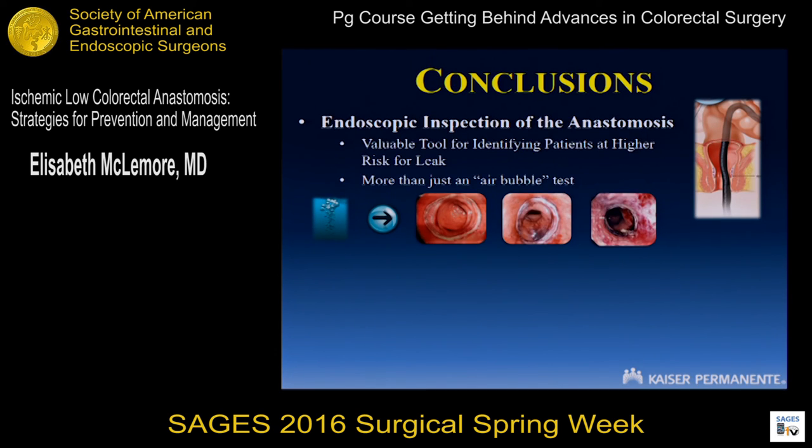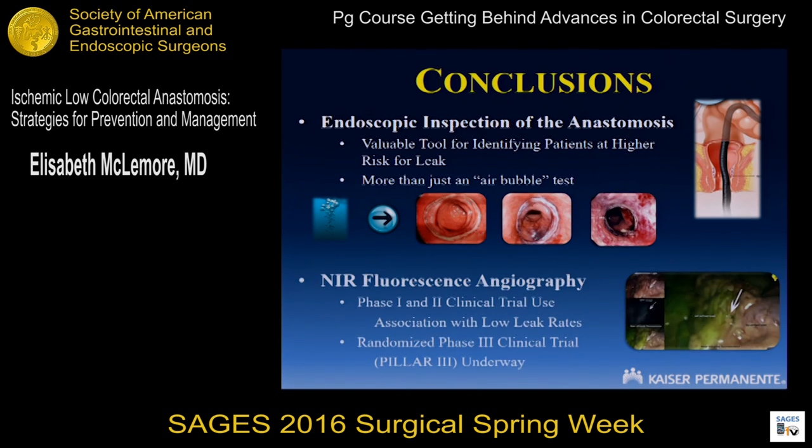So in conclusion, I think if you're not doing endoscopic evaluation, you ought to. I think most people are. It's more than just an air leak test, and I really try to get our residents to document in their operative notes the perfusion of the mucosa, whether you're using white light or near-infrared imaging, that the perfusion of the mucosa is assessed as well as an air leak test.